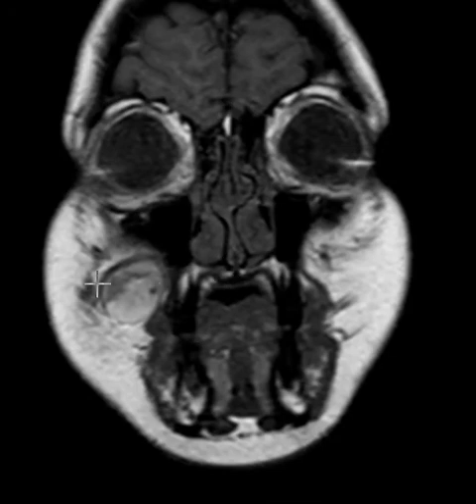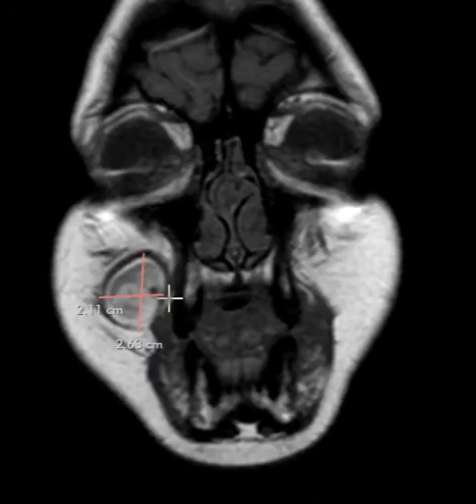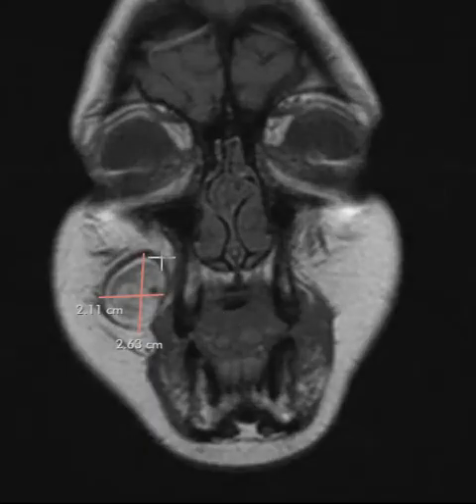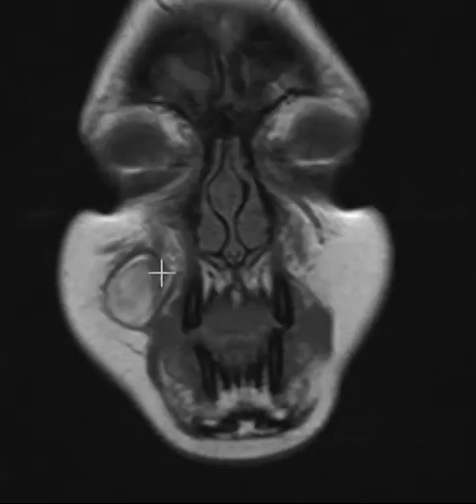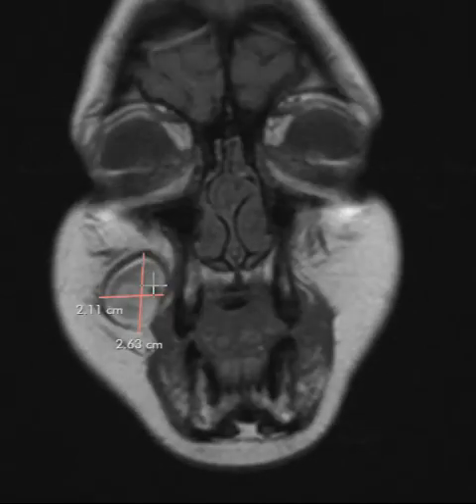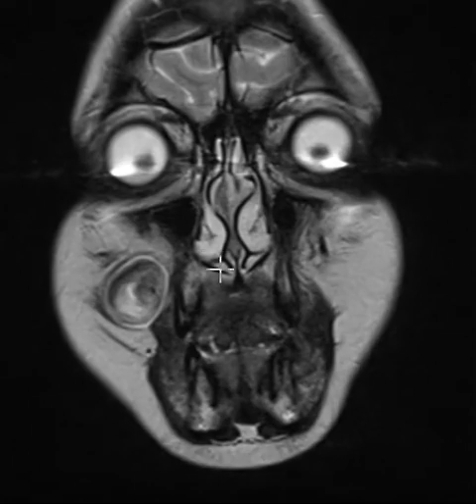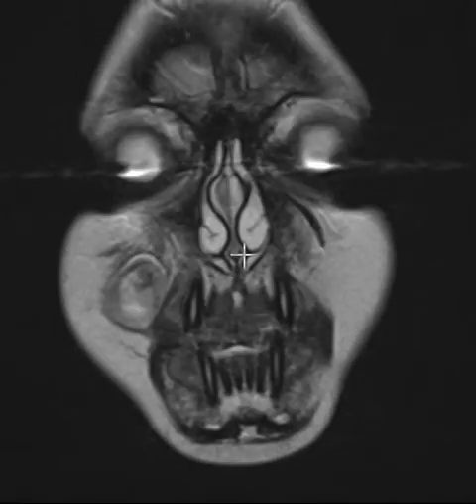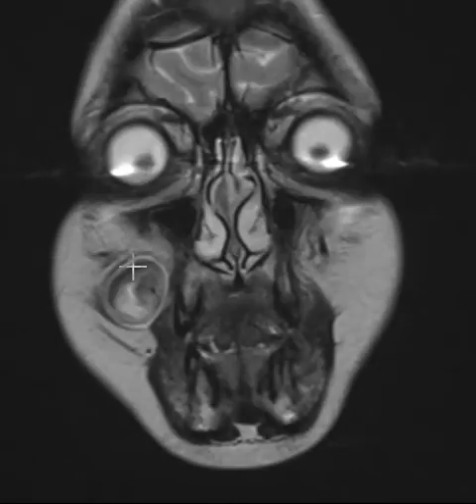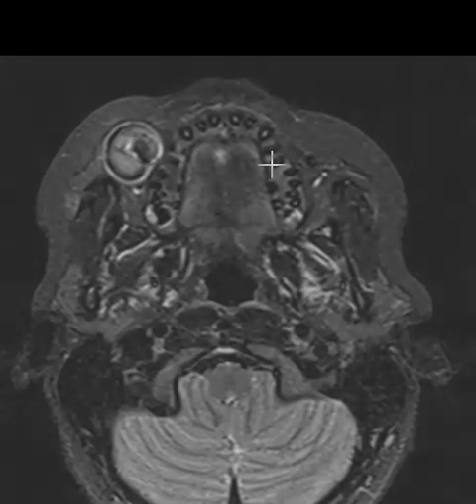Here is the lesion right there. Really sharply defined margins and sort of mixed signal intensity within it. Another sequence showing the same thing here. And finally, this sequence has got a STIR sequence, so fat is now dark.